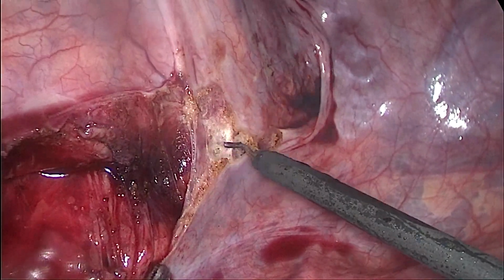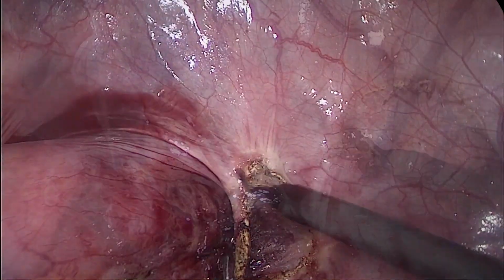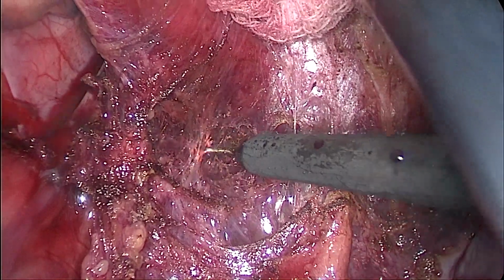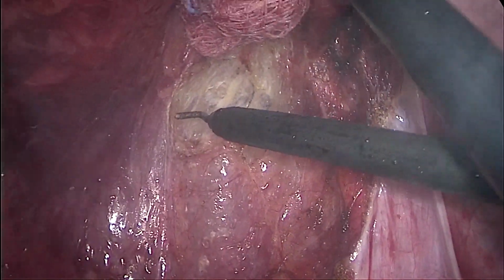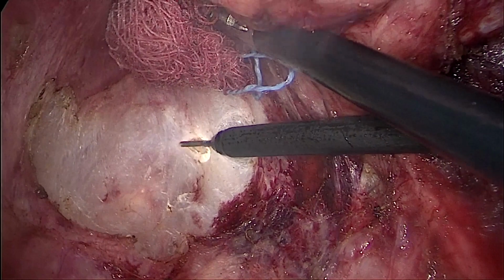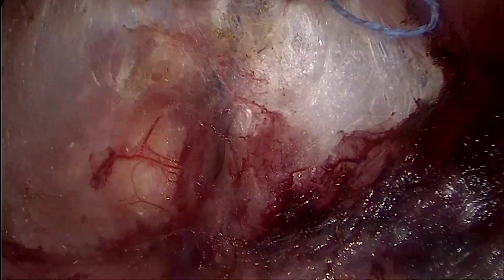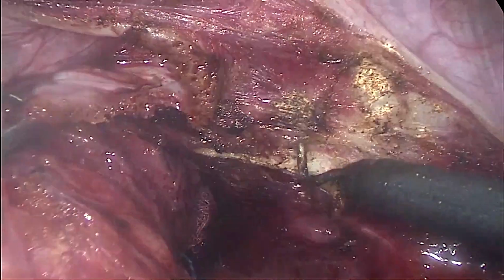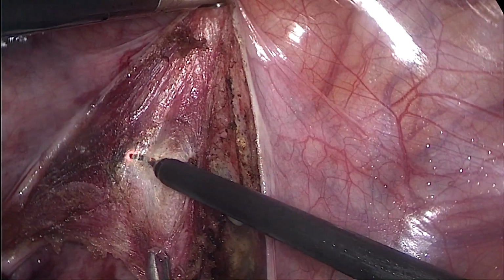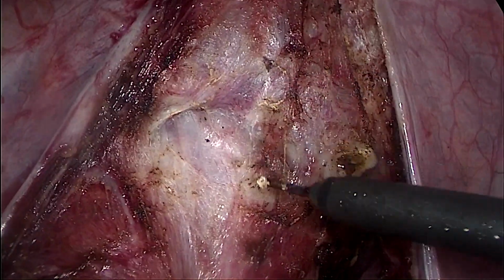So this is the left side and the right side of the total mesorectal excision. We prefer, even in inflammatory cases or non-oncological cases, to perform the total mesorectal excision, going in this avascular plane, avoiding the nerve injuries, the hypogastric nerve injuries, or other plexus injuries. So now we go to the posterior. We have to resect all the rectum because there were plenty of polyps in the rectum, more than 30 polyps, a lot more than that.